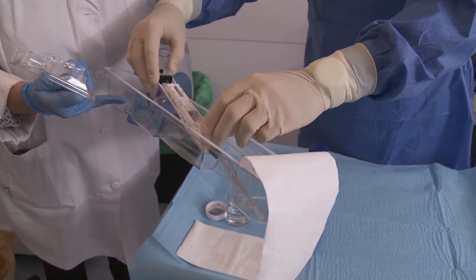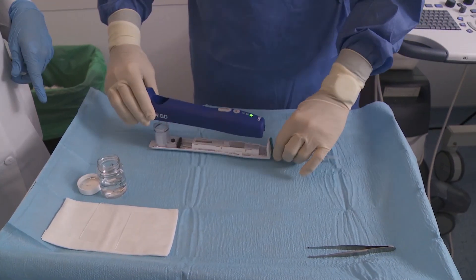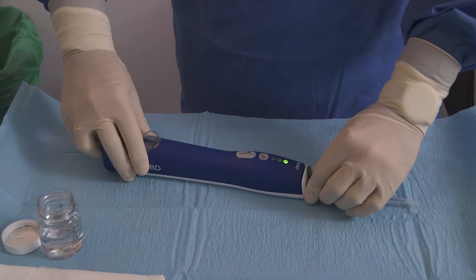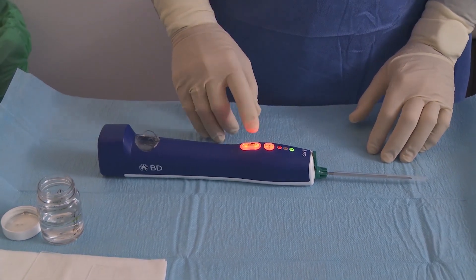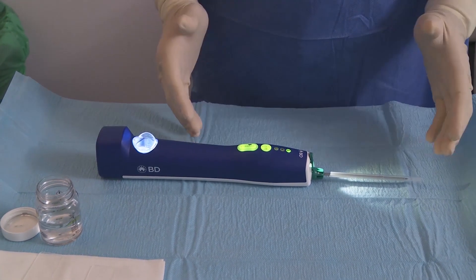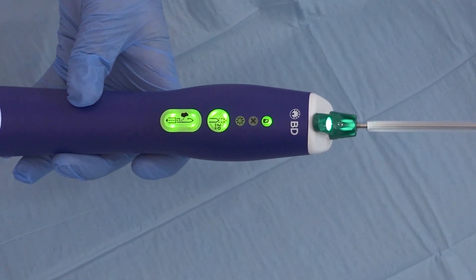Attach the probe to the driver, aligning the sample container and the probe tabs with the dedicated slots in the driver. Slide the probe back to lock it in place. The sampling button blinks green. Press once to synchronise the driver with the probe. The device is ready when the sampling and prime pierce buttons show solid green.